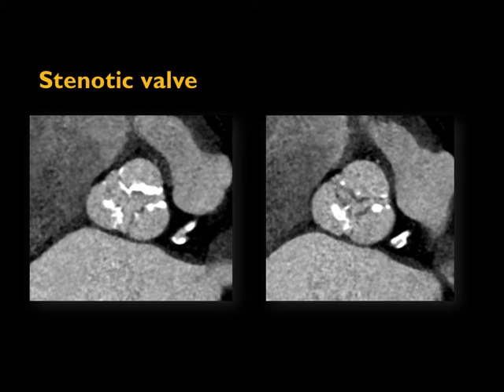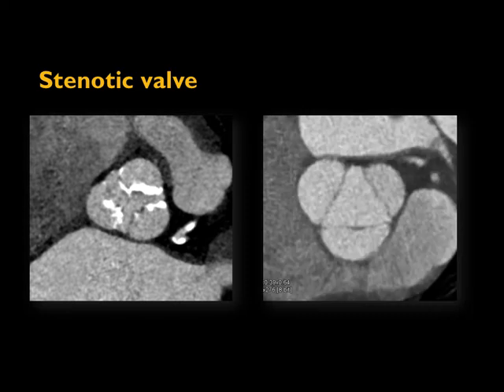Here's an example of what a stenotic valve looks like. In this patient with a stenotic valve, you can see the valve not only is calcified but also just doesn't open up as much as the normal valve we saw before. This is the problem in patients with aortic stenosis — you get a restricted opening of the valve itself.